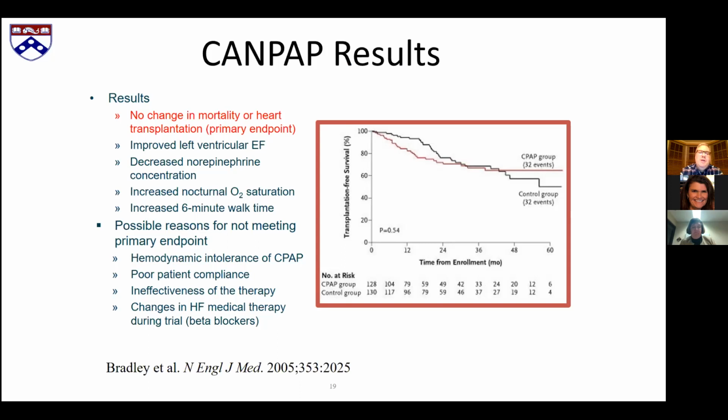We also noted that some of these patients had some hemodynamic intolerance to CPAP. We've seen this once or twice where their blood pressure falls. And so we really did worry that perhaps this modality of treatment, CPAP itself, may not be the best choice for patients with central sleep apnea and heart failure, or even central sleep apnea alone. One other concern was, were we triggering hyperventilation in patients with Cheyne-Stokes who were on positive pressure ventilation?